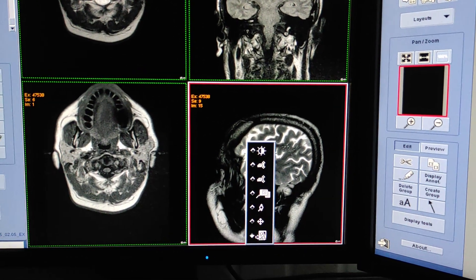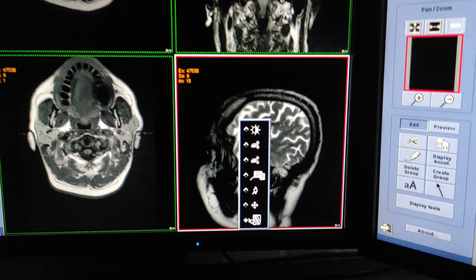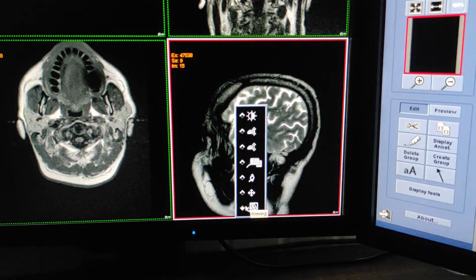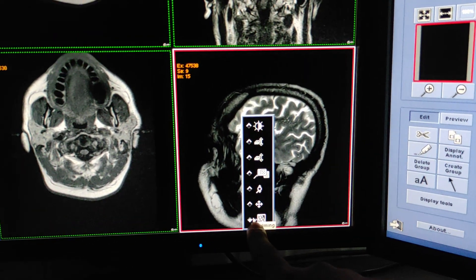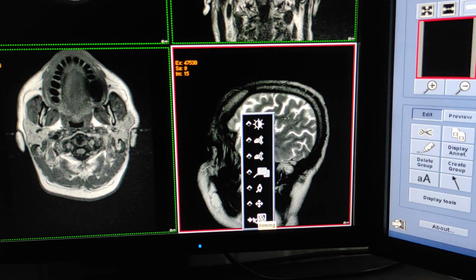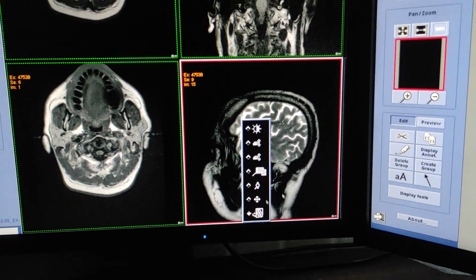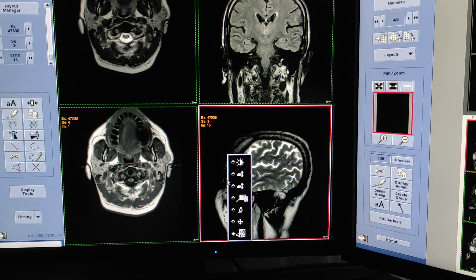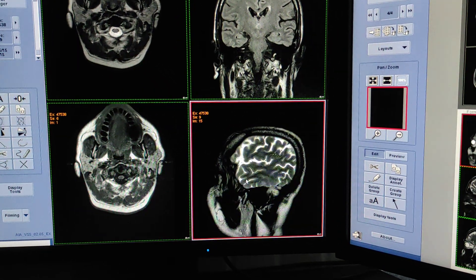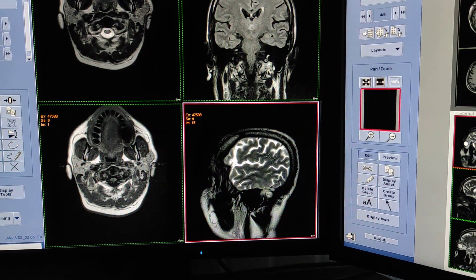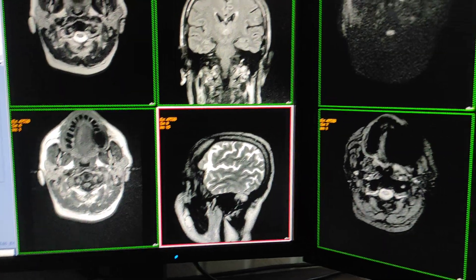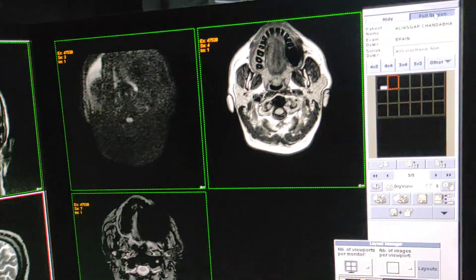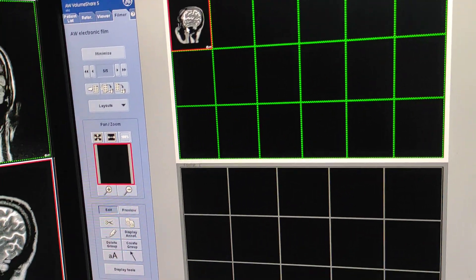You can also enter images with the mouse. Right-click and select the filming option, then you can enter with the middle mouse button click — it will go directly into the film. To scroll you have to click scroll.